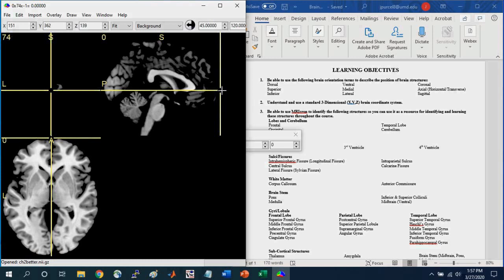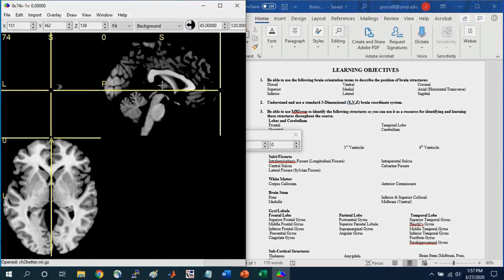And so there's 180 millimeters from between posterior and anterior for this particular brain. And again, this is only true for brains that are actually warped and converted into this standard MNI space. So keep that in mind.